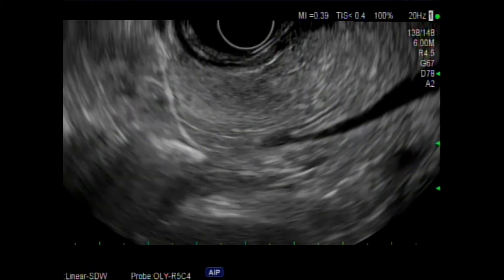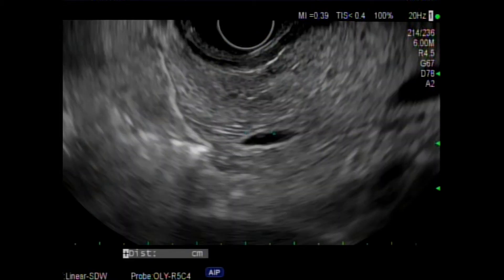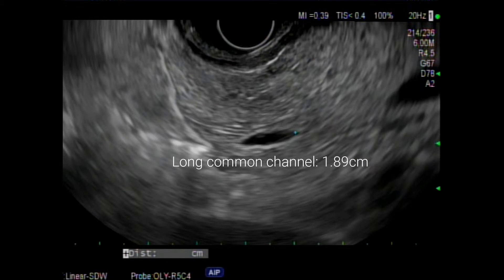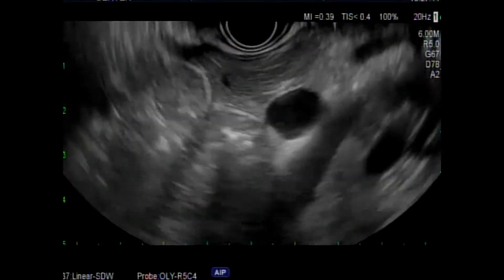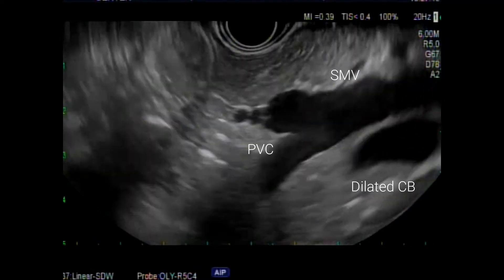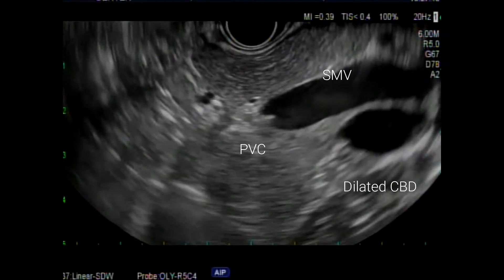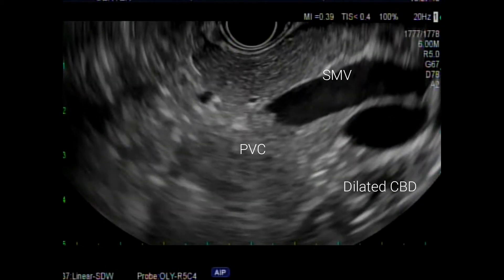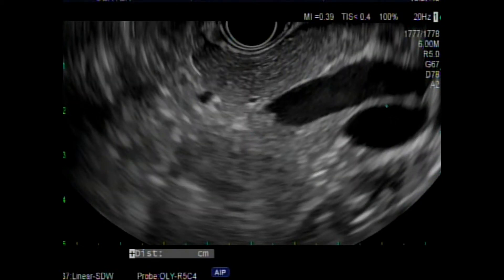A long common channel is considered to be greater than 9mm, and when measured here from the ampulla to where it divides, it was 1.89cm. With gentle withdrawal of the transducer into the stomach, the dilated CBD can be seen at the other side of the confluence. When measured, it was 1cm.